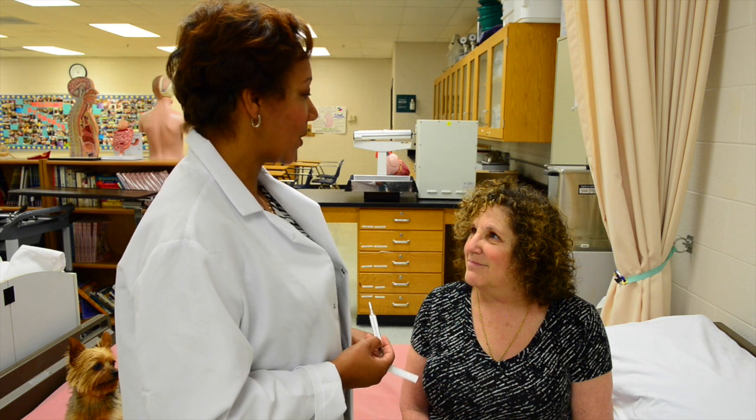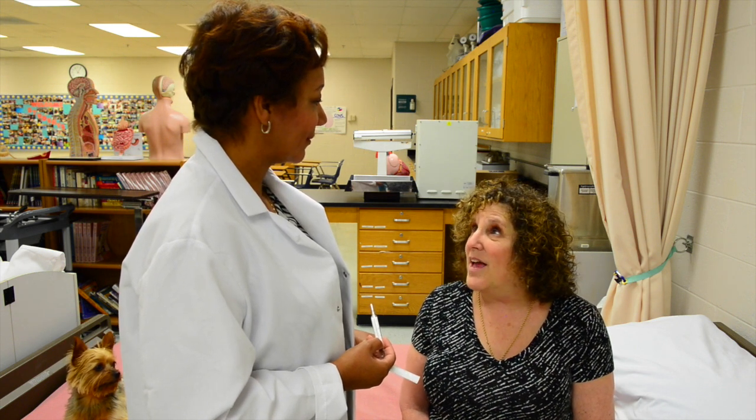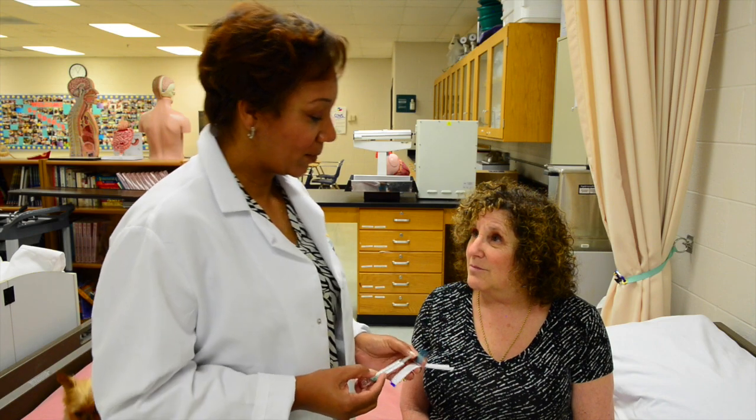The first thing you want to do after you've assembled your supplies is introduce yourself to your patient. Hello, I am Dr. Edie Wilson. Hi, I'm Ellen Katzewicz. Okay Ellen, today we will be taking your temperature.